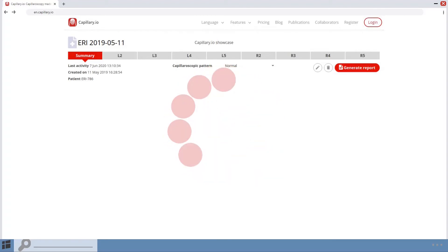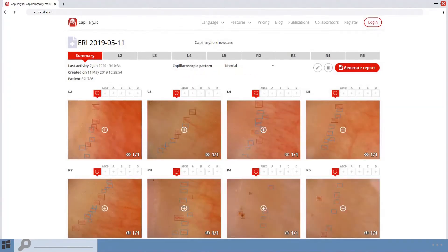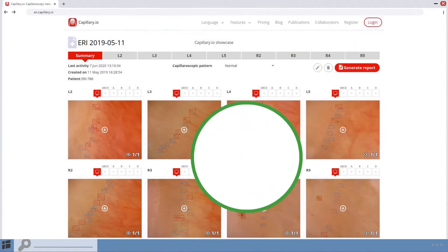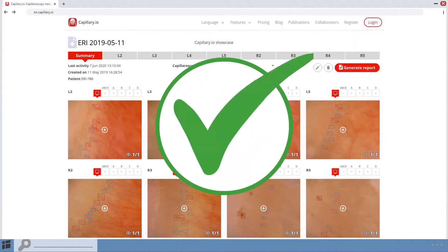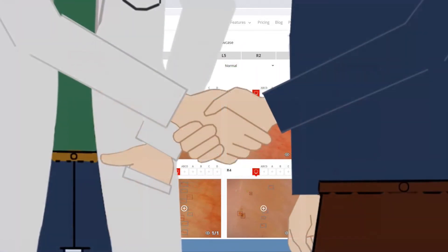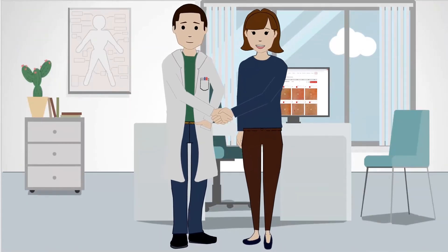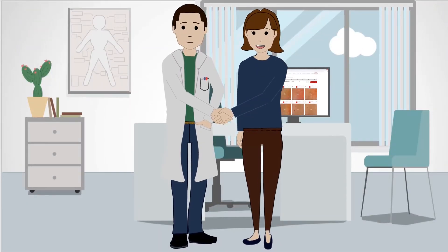Once the images are uploaded, our artificial intelligence will analyze the images and you will get a capilloroscopy report instantly. This will save hours of manual processing.